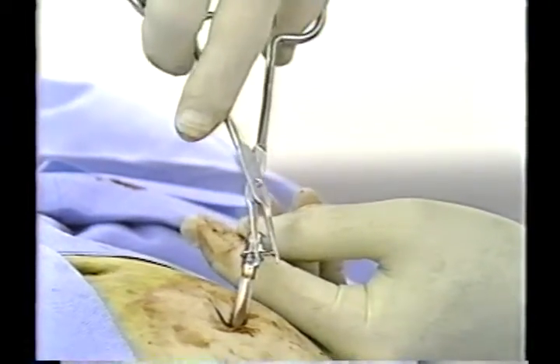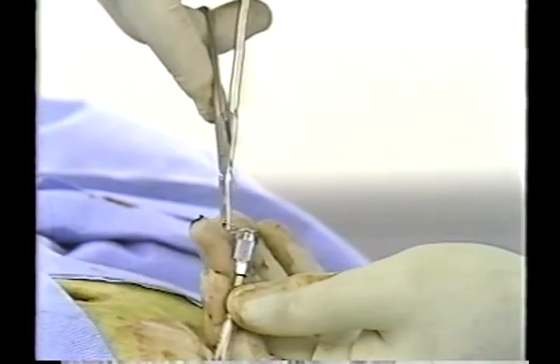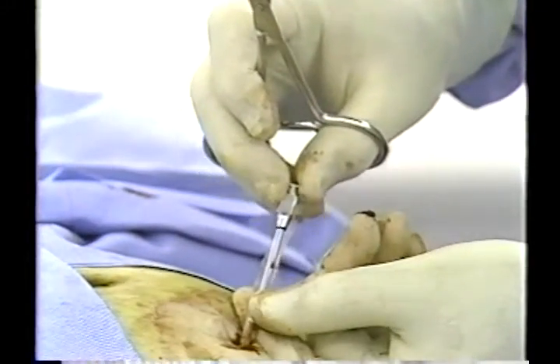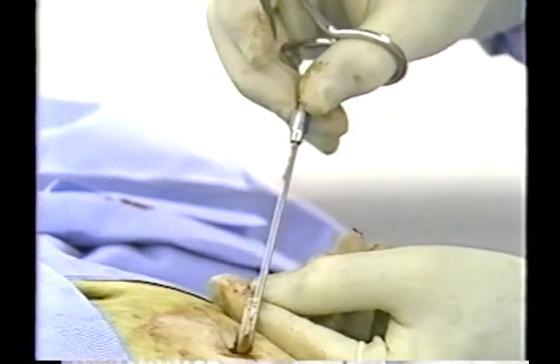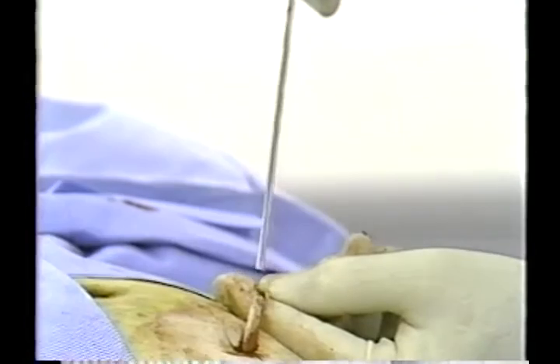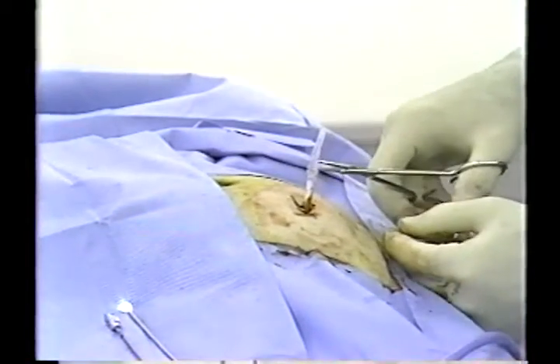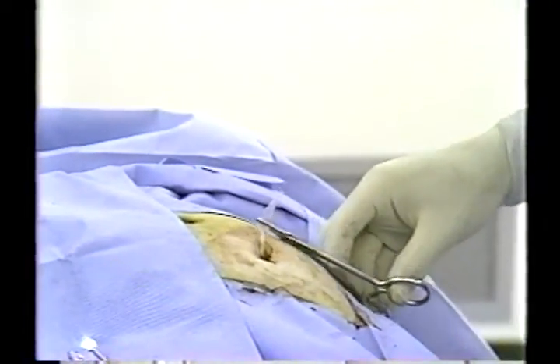The retention ring surrounding the catheter guide and cannula is then removed using a pair of hemostats. The cannula is also removed by a slight twisting motion while slowly withdrawing, leaving the quill catheter guide in the same path previously occupied by the needle scope. The catheter guide is then grasped by hemostats at the lower end of the protruding tab.